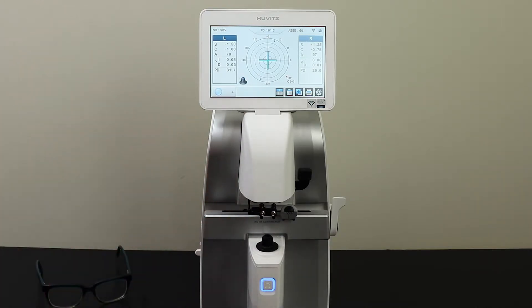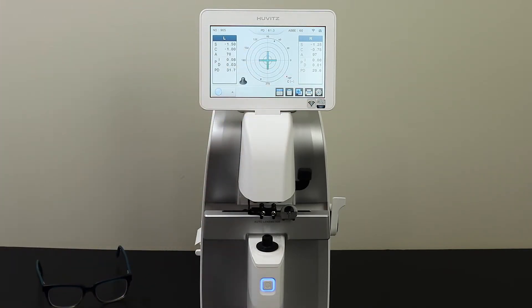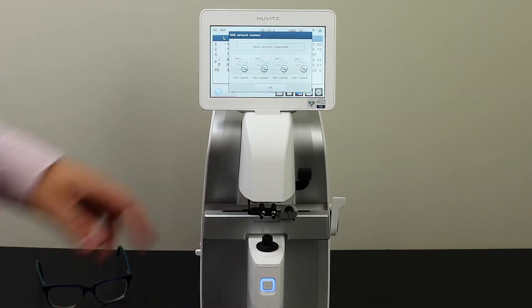When you are finished neutralizing your lenses, press the printer icon in the lower right-hand corner of the screen. This will give you a readout of your prescription and also send the information via Wi-Fi to your digital refractor.